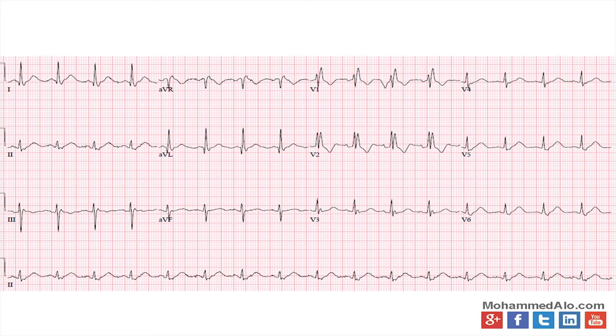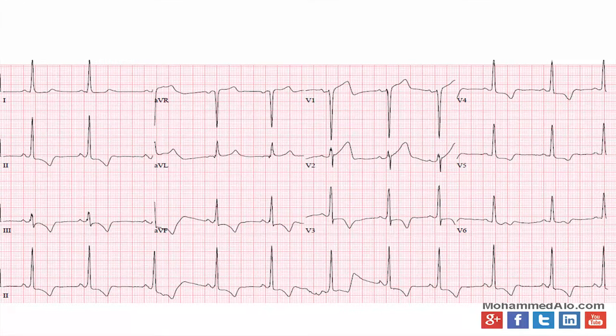The next one here, obviously have a right bundle branch block. And that's about it, really. I don't see much else exciting on that one. Mainly right bundle branch block. Doesn't really look like anything. It definitely doesn't look like an anterior STEMI.